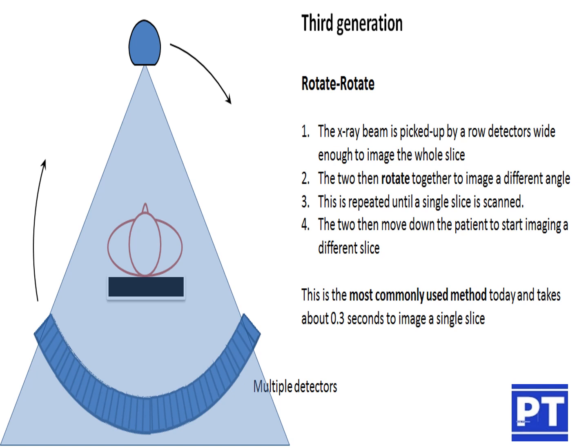The peculiarity of this third generation CT is that when we are setting up the patient on the couch, the X-ray tube and the detectors will be moving clockwise as well as anti-clockwise. For example, if we are imaging a CT brain, the area of interest is from the vertex up to the base of the skull. If we are covering that area with a 5 mm slice thickness, we set up a table index in this conventional modality.